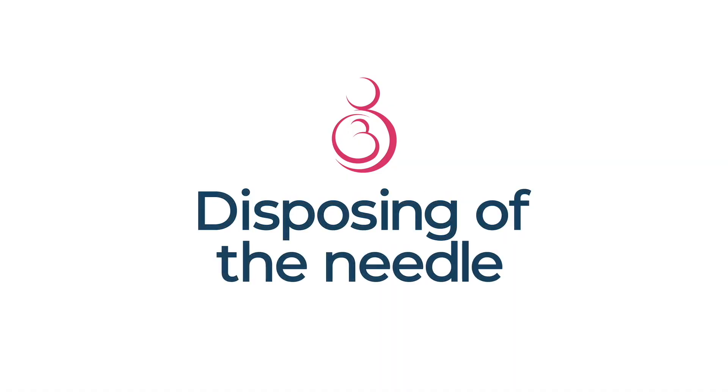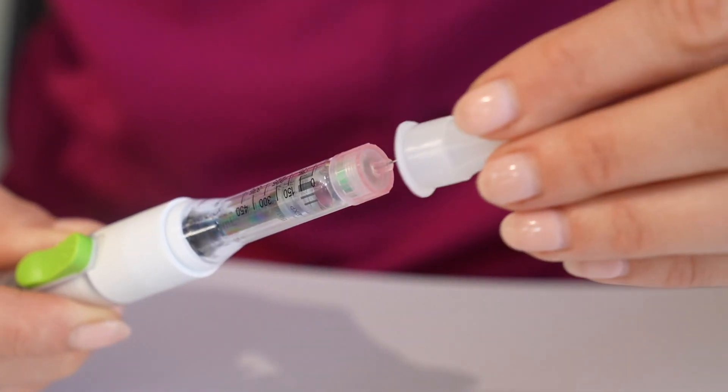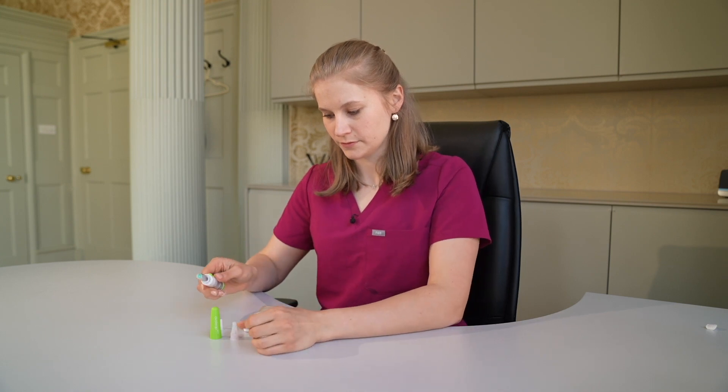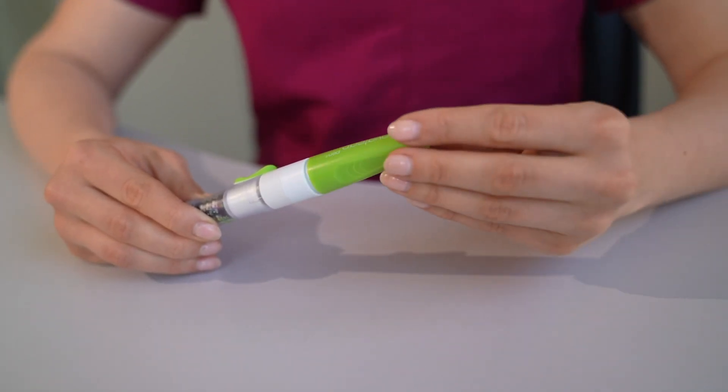Disposing the needle. Recover the needle with the larger cap and unscrew it to dispose of it safely, preferably in a sharps bin. Put the green lid back on the pen, as it now contains the medication and must be stored in the fridge. And that's it!